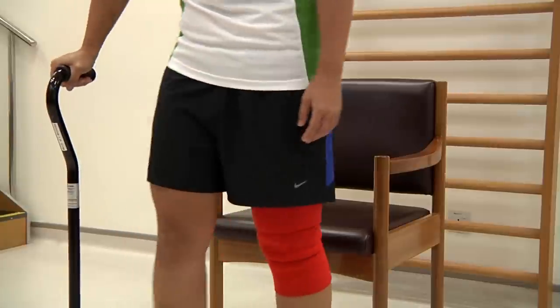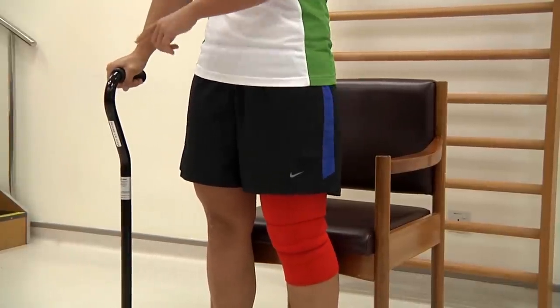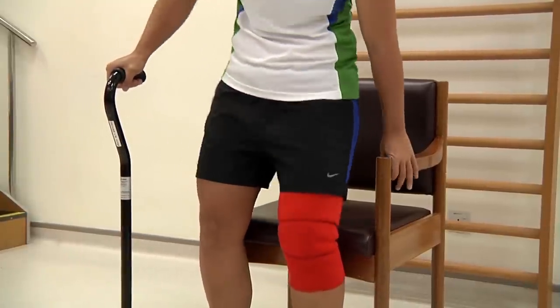To sit down, move back slowly to feel the edge of the chair. Keep one hand on the stick, one hand on the chair, and lower yourself down slowly.